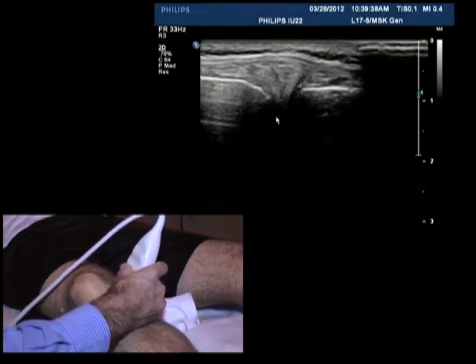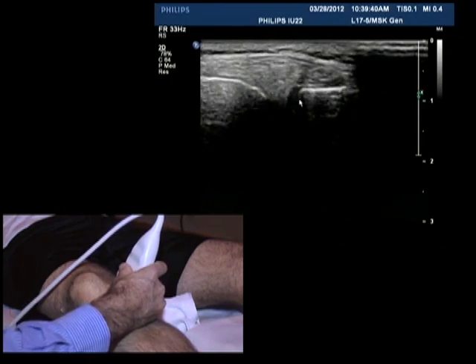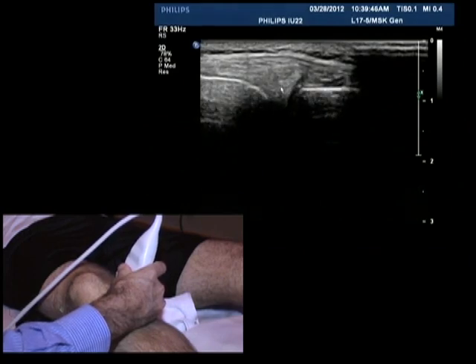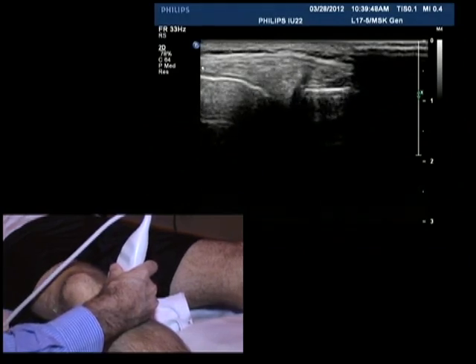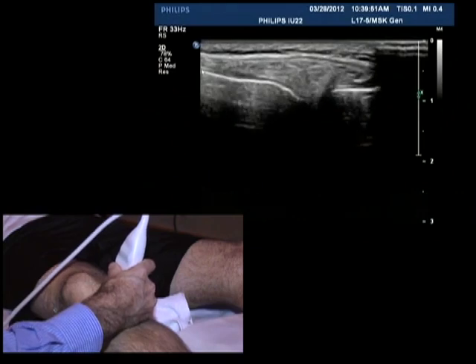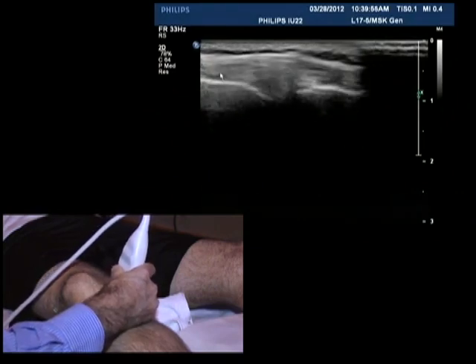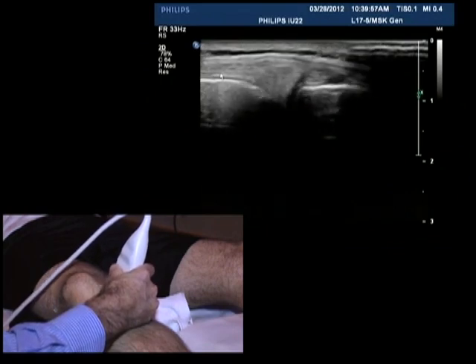So if we look, right, look, here's medial femoral condyle. Look at my probe. It's basically a coronal image, right? Here's medial tibial condyle. Here's body of the medial meniscus. This is all, actually we see it beautifully. This is all medial collateral ligament.